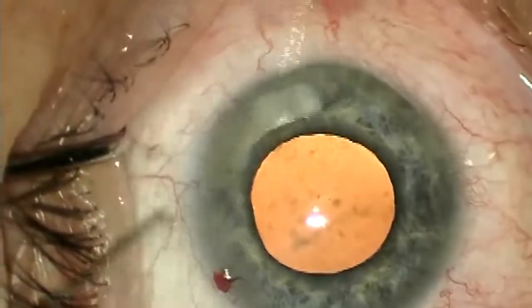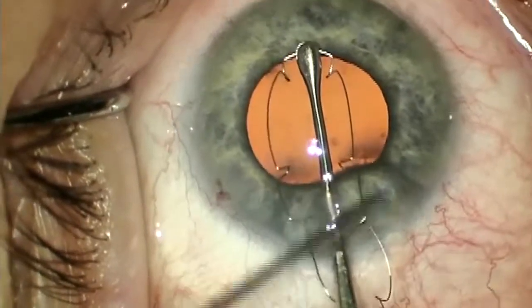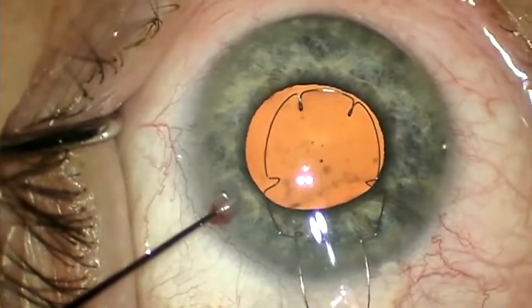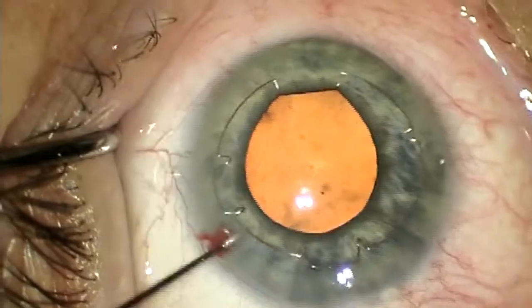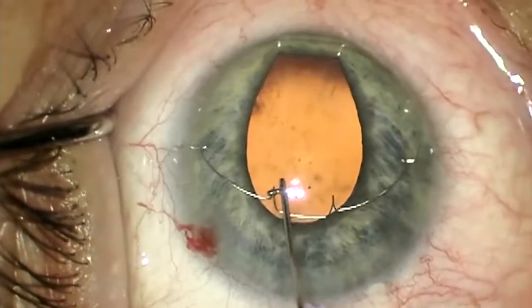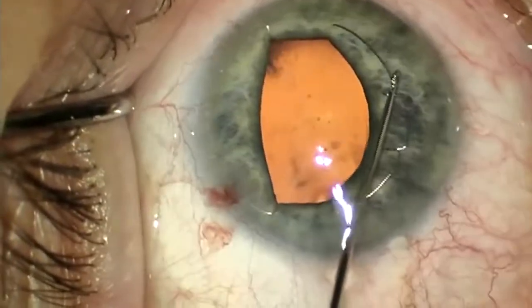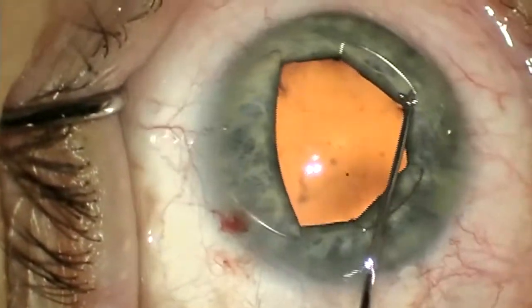I stabilize the globe with a Lester hook through the side port and push the ring into the anterior chamber. The ring is going to get held up on the proximal bend of the lateral hooks. It's advanced further into the eye by simply nudging the hooks that are stuck immediately within the incision while maintaining some forward pressure on the ring. Once the lateral hooks are inside, open and close the forceps, dropping the footplate into the anterior chamber, grab the ring, and place it. The key is to follow the contour of the globe anteriorly while pushing the ring in. Once it's totally in the anterior chamber, I engage the distal, proximal, right, then left hooks. Now the pupil is safely expanded and held captive within the X-band iris speculum.